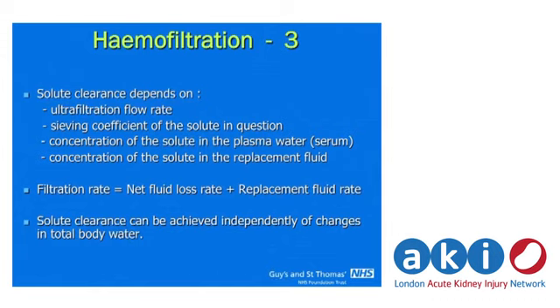The other thing in terminology is the word exchange, because this is a kind of exchange. You're taking filtrate off, you're giving replacement fluid instead, and that term also gets used in a very general way, also for dialysis, if it's in dialysis mode, which isn't quite right. And the other thing is the term filter. So this item here is the same item, whichever modality you're in, whether it's dialysis, diafiltration or filtration, but people commonly refer to it as a filter. In fact, many people refer to the whole machine as a filter.